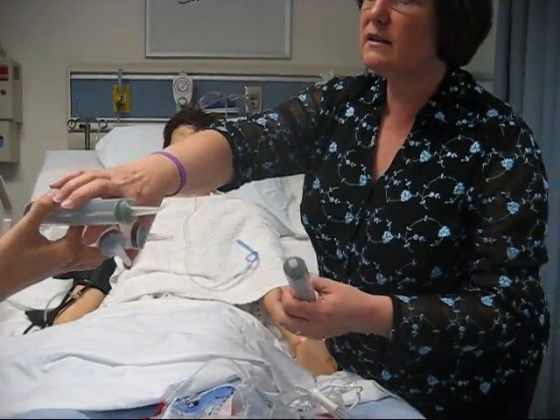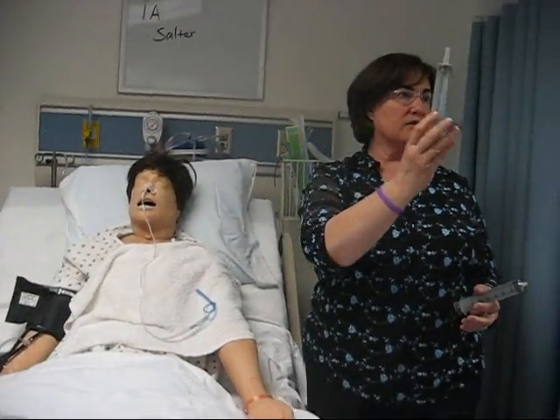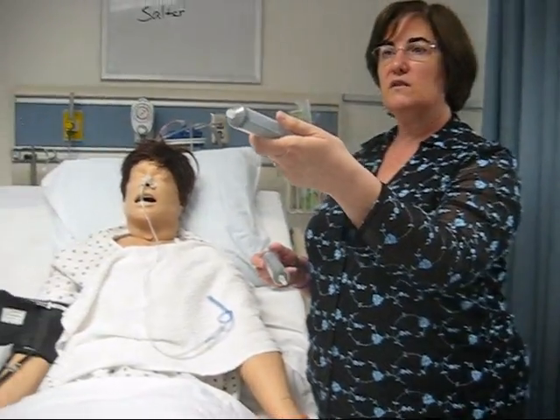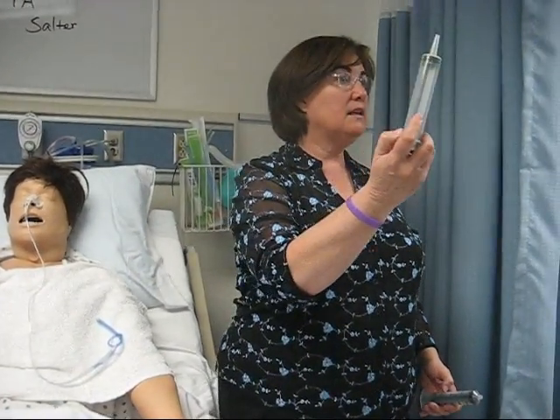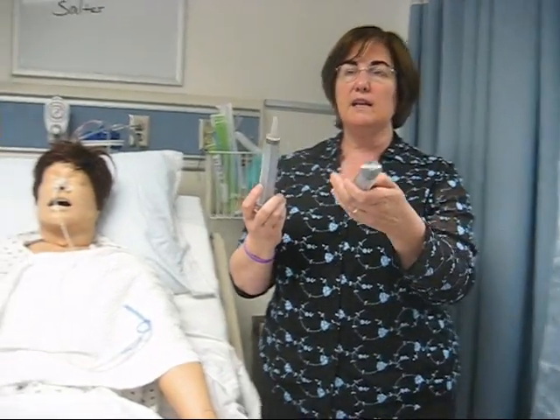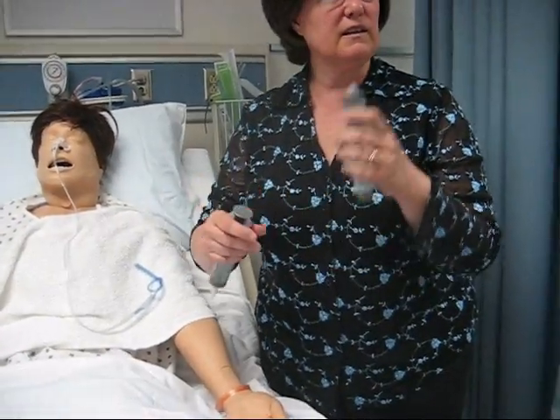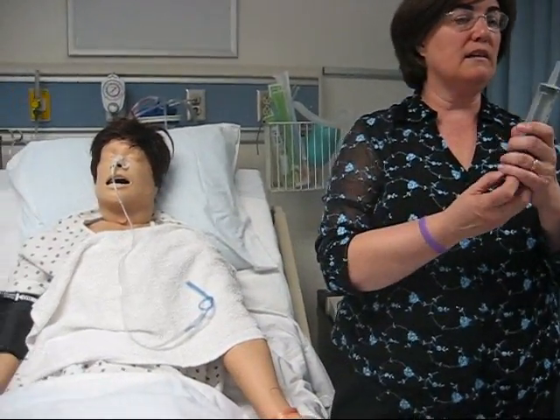All right, so there are different kinds of syringes. These are very large syringes. These are 60 mL or 2-ounce syringes. And this one's called a Luer lock, L-U-E-R. A Luer lock is a threaded one. It's for needles, something like that. And this is called a catheter tip, meaning it's used with tubes. So you wouldn't do this. Open the package. Yeah, and they're labeled on the outside. See, the same size and the whole thing, but the purpose is different. And if you tried to put this in there, it would cause all kinds of problems. But this is a catheter tip.